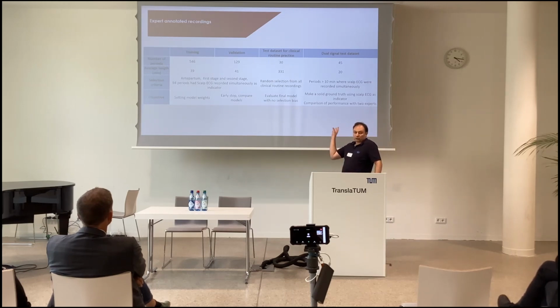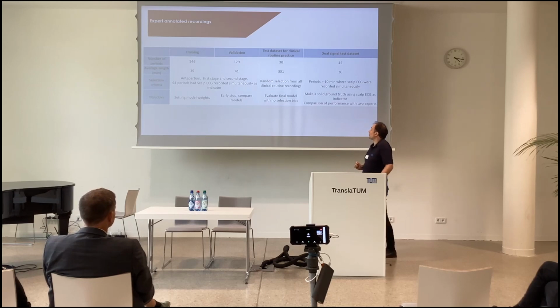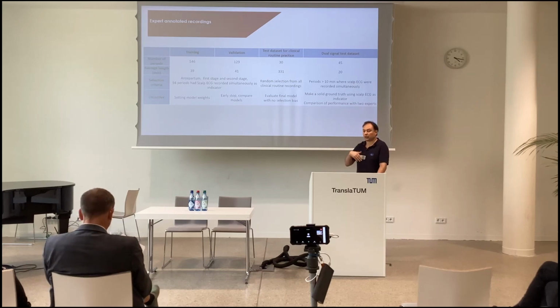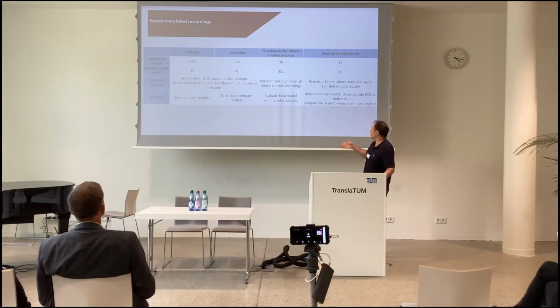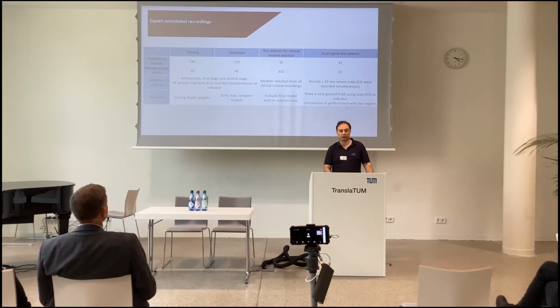We have done 2 test data sets. One to estimate the performance in routine clinical practice, and a second data set with dual signals, that is to say we have the scalp ECG at the same time as the Doppler, which enables us to make a solid ground truth. And we use this second data set to compare performance with 2 experts, to know if the method is better than experts.